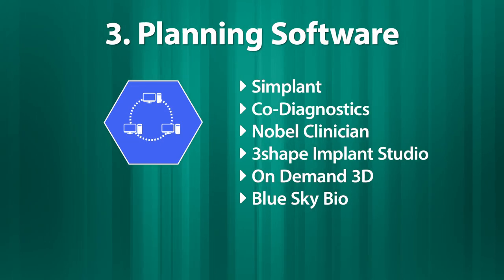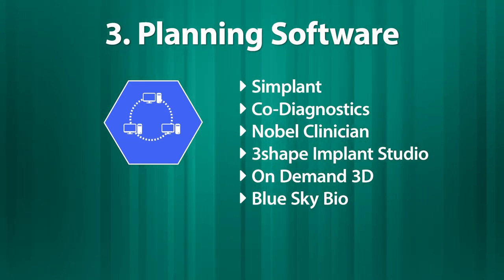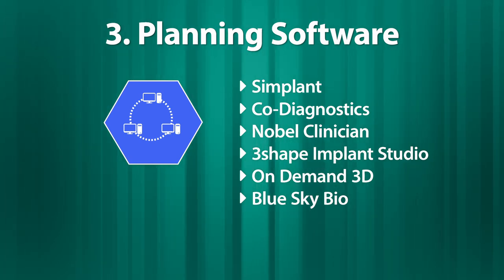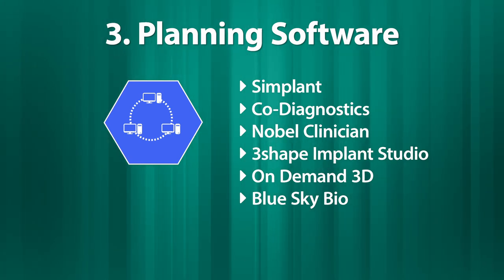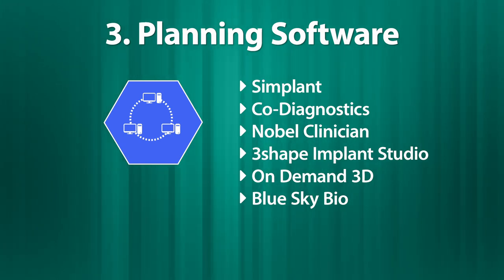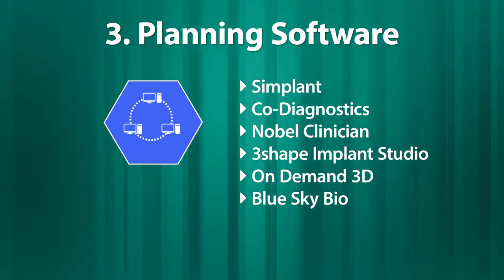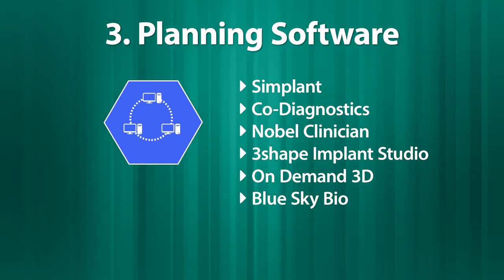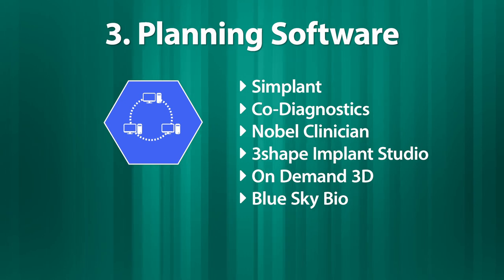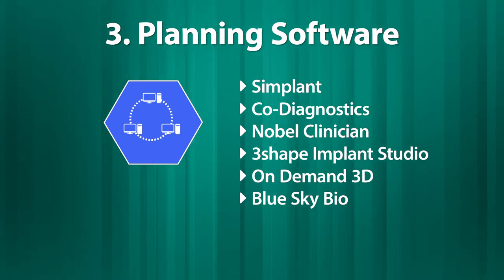The third step in the workflow is using implant planning software to simulate the treatment plan and virtually place the implants after an accurate registration of the CBCT and the STL files. There are many software packages in the market, such as Simplant, Co-Diagnostix, Nobel Clinician, 3Shape Implant Studio, OnDemand3D, and BlueSkyPlan.